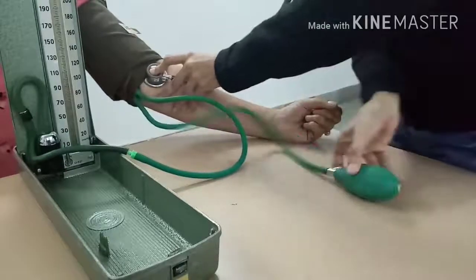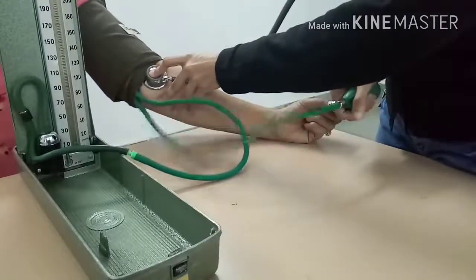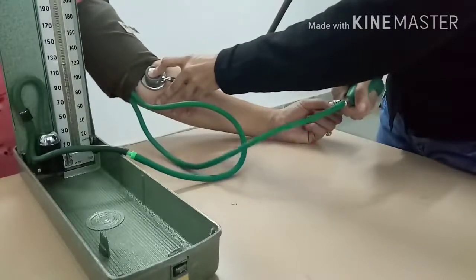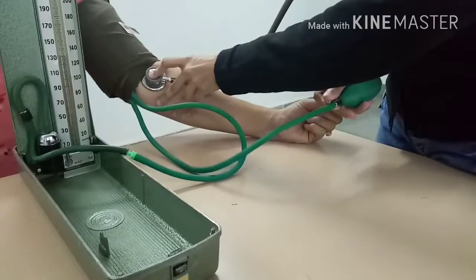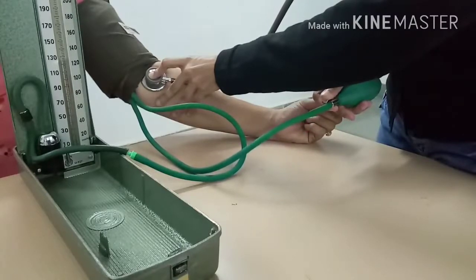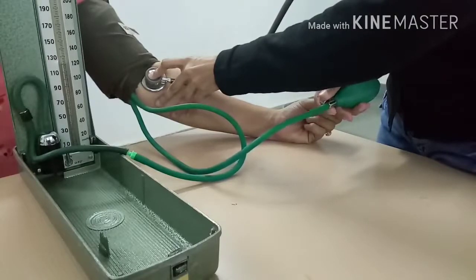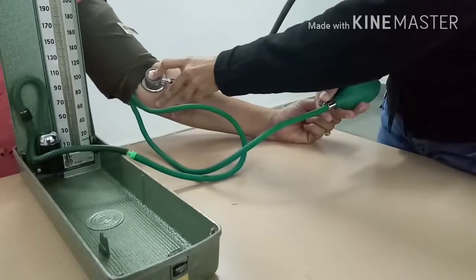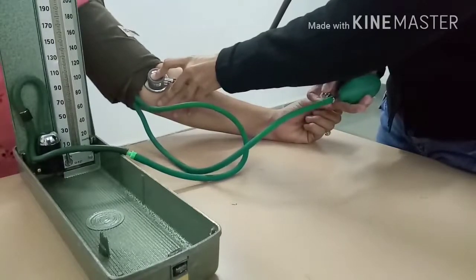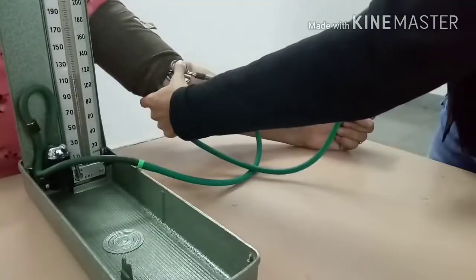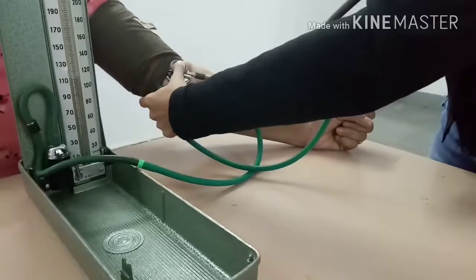Now inflate the cuff to a few millimeters of mercury above the pressure observed by palpatory method, then deflate it slowly and listen to the appearance of a series of sounds known as Korotkoff sounds. The pressure at which the sound appears is the point of systolic pressure.